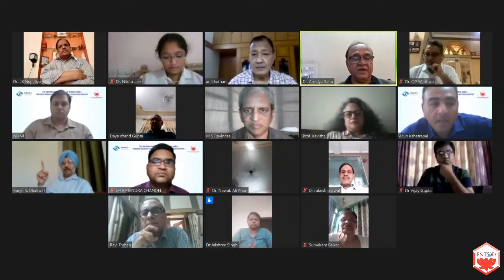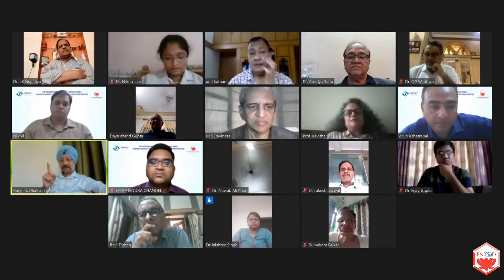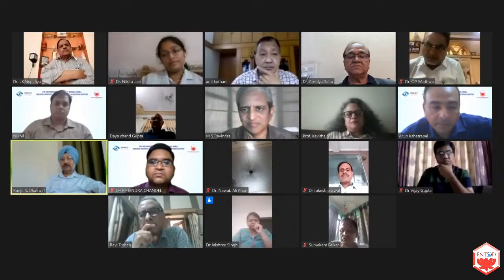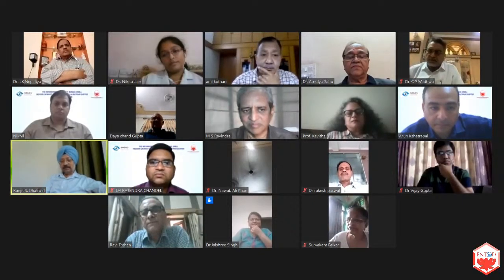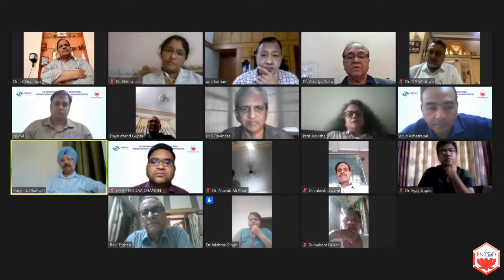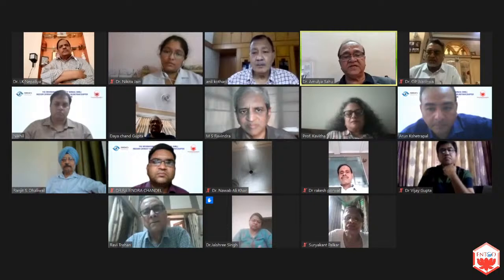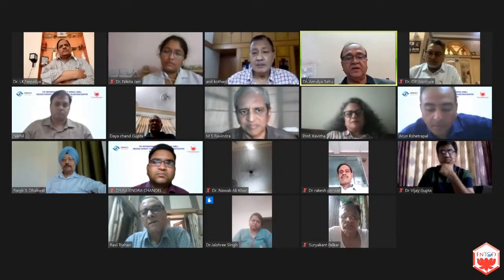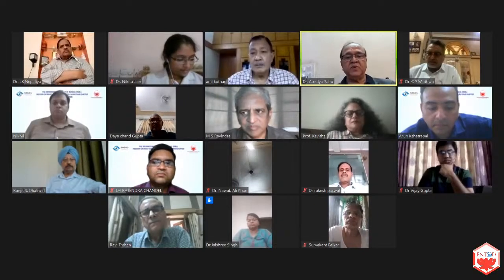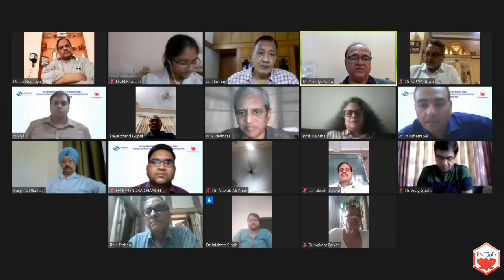That's my thinking. Yes, and I would like to add here, the charm of SICS is we can spare the limbal stem cells, so we go scleral. I won't prefer even a limbal incision, because we must spare the stem cells. Let me rephrase my sentence: we can save a patient from becoming a dry eye case with SICS. That is a good point, but it is a point for research. We have not done sufficient research to give an opinion; it is at an experimental stage, and Ravindra has developed it. Let us have some people go into research and come out with how much limbal cell we are losing, and that will be a good help for all of us.